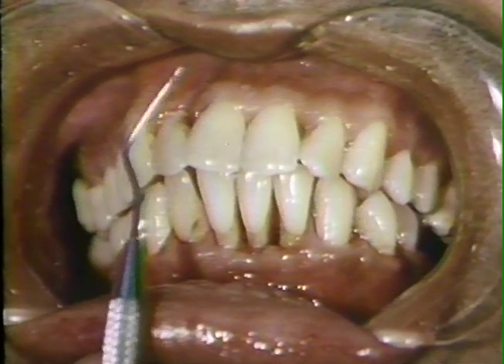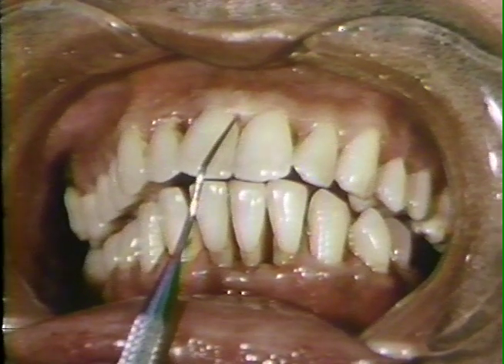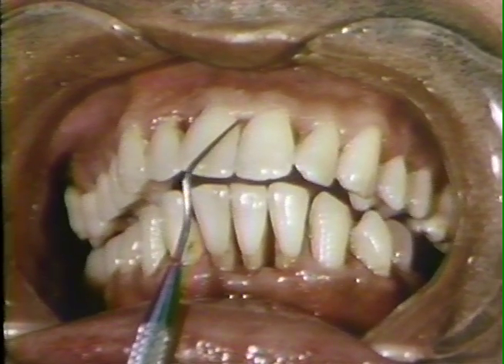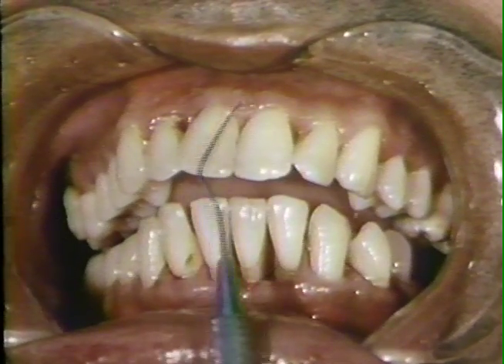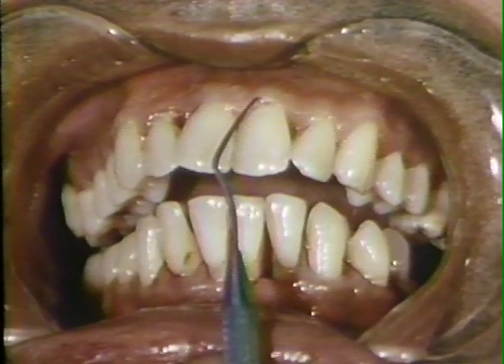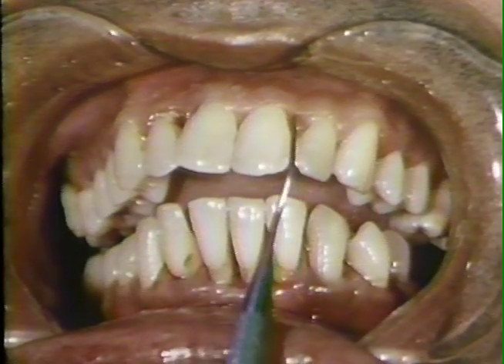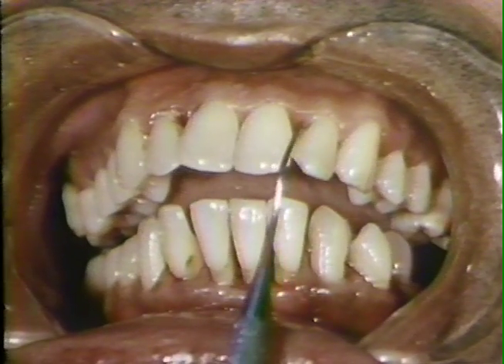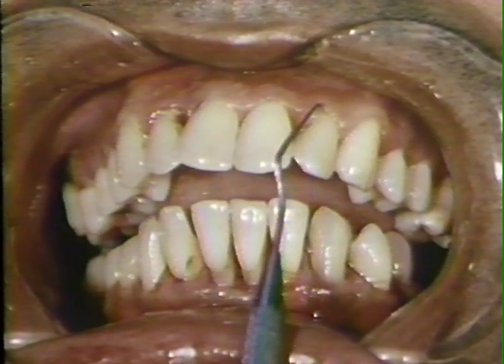After scaling and root planing, the tooth surfaces are checked with a number 17 Explorer to assure that all calculus has been removed and the tooth surfaces are smooth. The instrument should be placed into the gingival crevice with its tip flat on the tooth. Then, the tip of the instrument is turned toward the tooth to feel for irregularities.